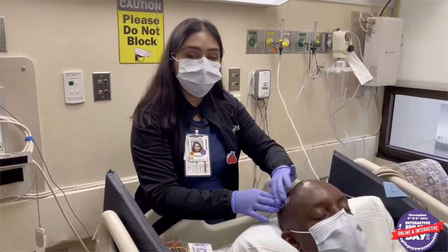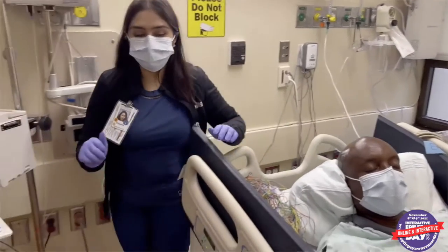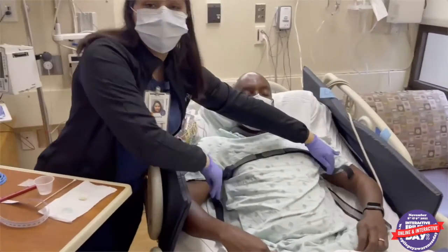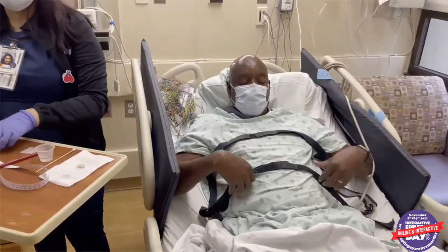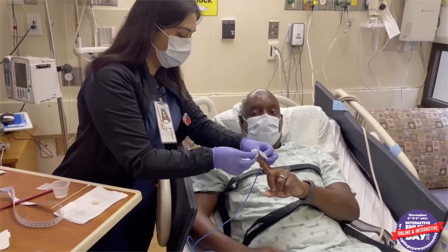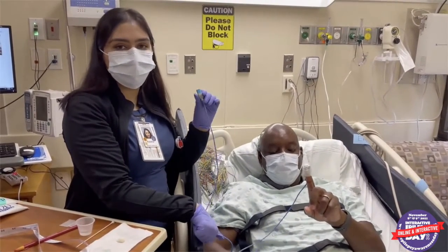So the electrode will stick on its own with this adhesive, so you won't need to cut your hair for it to stick any better. After we put all 26 of these electrodes on, we'll put our respiratory belts and our pulse ox. So you'll have 2 belts, one over the chest here, and one over the abdomen here, as well as the pulse ox. The pulse ox will be plugged in separately, so you will need to ask your nurse if you need to go to the restroom to unplug this for you.